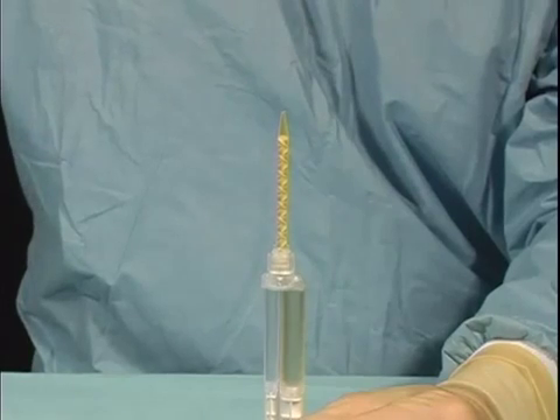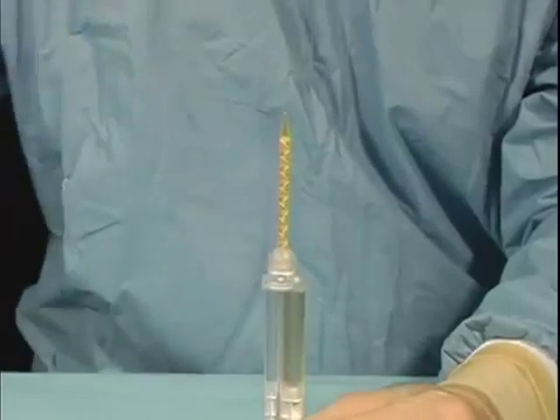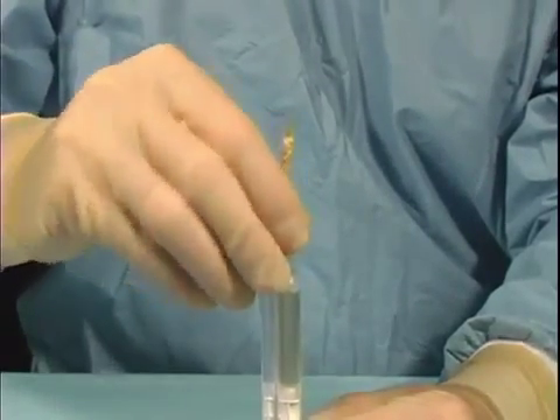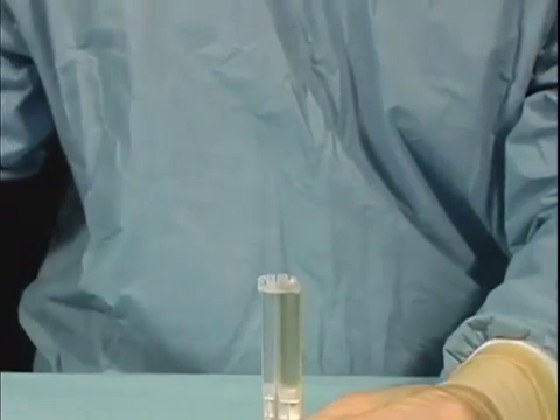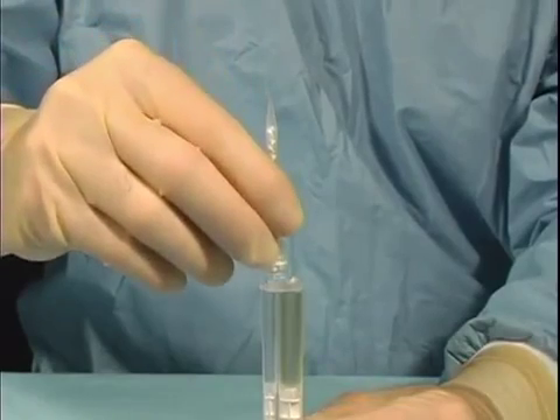To change an occluded applicator tip, hold the applicator tip collar, rotate 90 degrees counterclockwise, gently lift the applicator tip off of the syringe, attach a new applicator tip, and lock it in place.